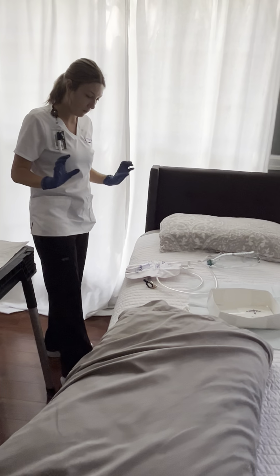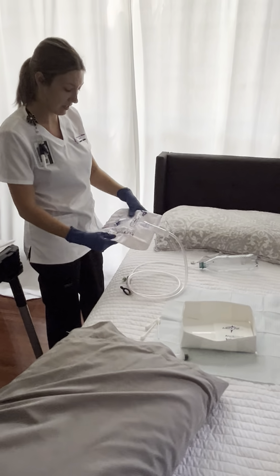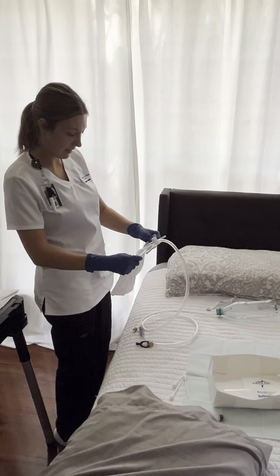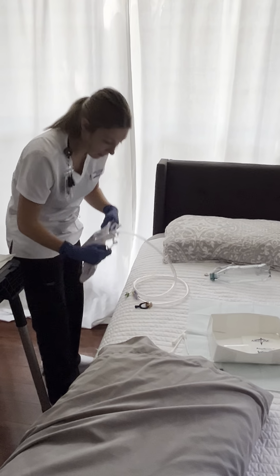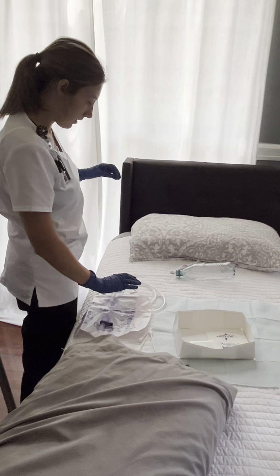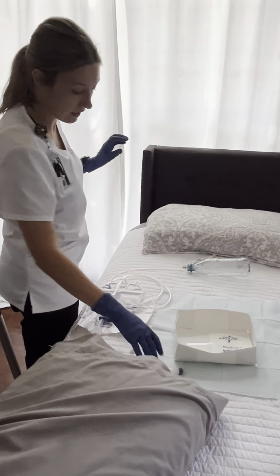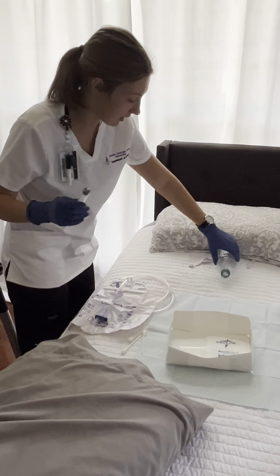So before I move forward, I'm going to look at the color of the urine, document the amount, color, consistency. Okay, and now I'm going to pick the bag up. I'm going to remove the stat lock and everything. Right. So now I'm going to get a clean syringe. Right there.